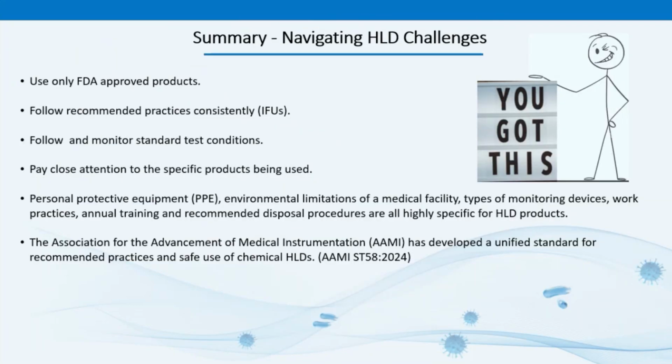So the list of challenges with HLD seems pretty long. Despite this, we still need to use this disinfection method until we figure out how to replace it, or there comes a time when we just don't need it. I don't have any easy solutions to navigating the many HLD challenges we've identified. I will tell you, you're not alone in your anxiety performing this very complex disinfection method for semi-critical devices.